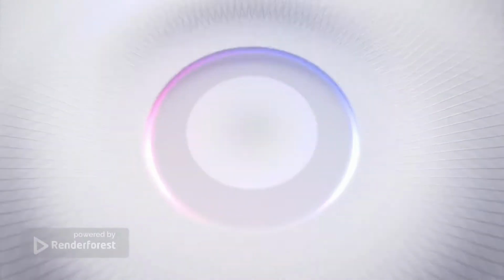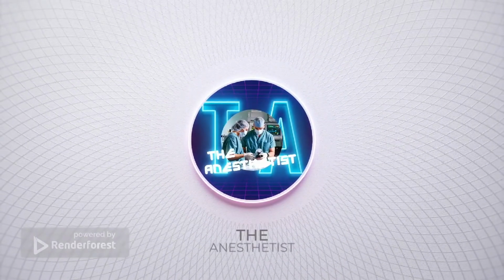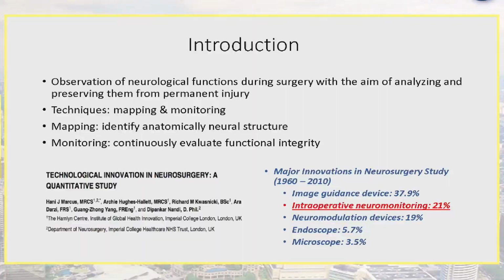My lectures about intraoperative neuromonitoring, physiology and application. It's an observation of neurological function during surgery, which can be divided into two techniques: mapping and monitoring. With mapping, we identify the anatomical neurostructures, which allows the surgeon to do the surgery without causing any harm to other vital structures and improves the post-operative outcome.